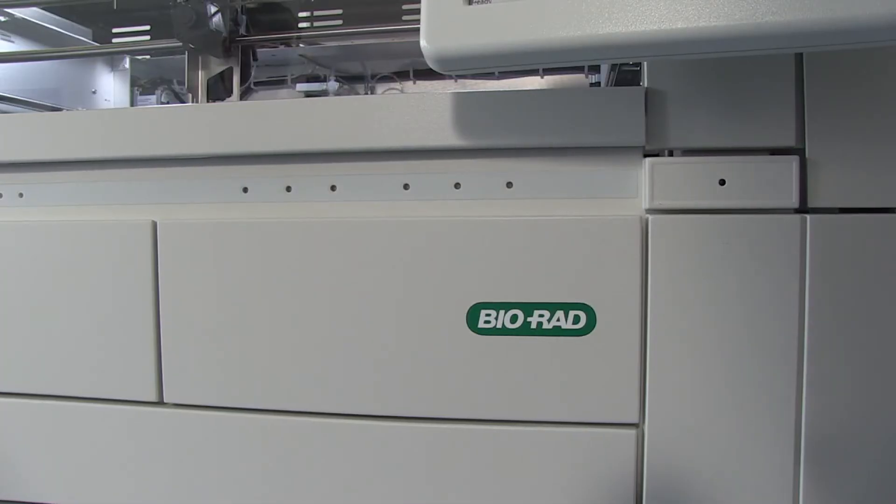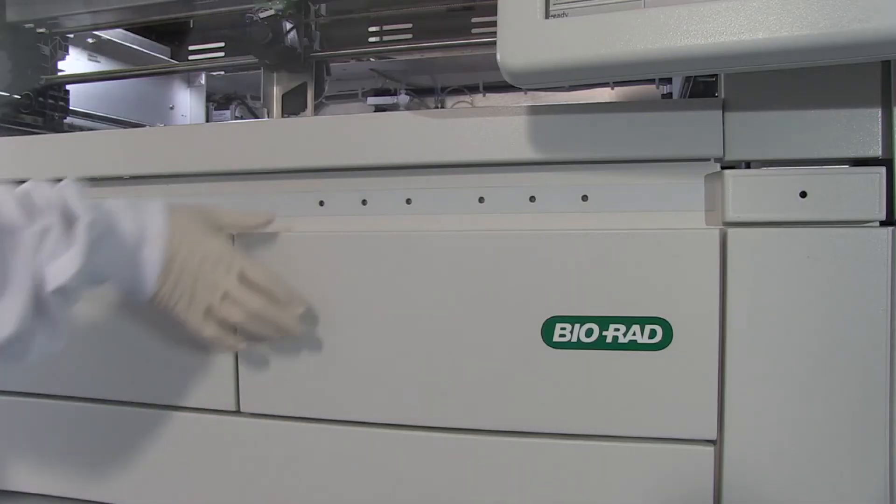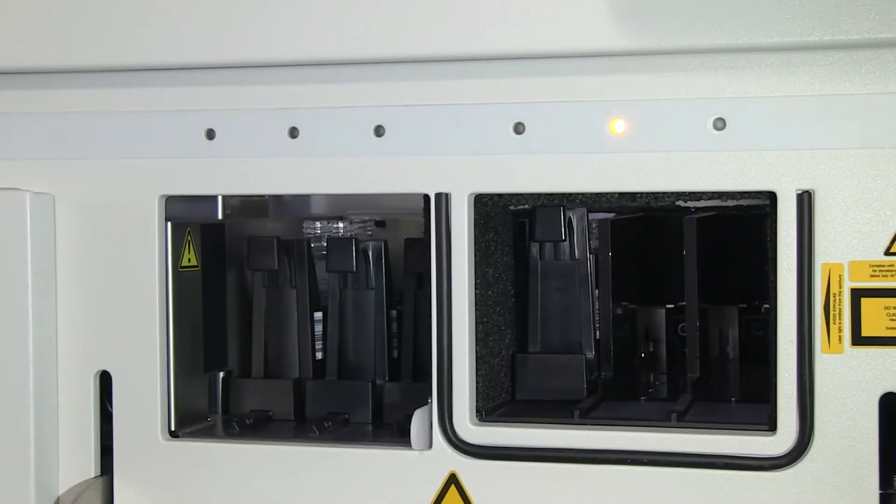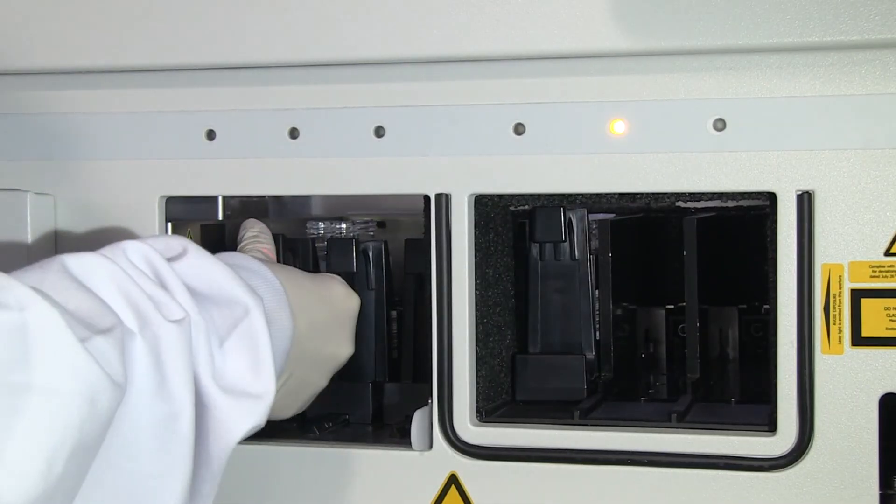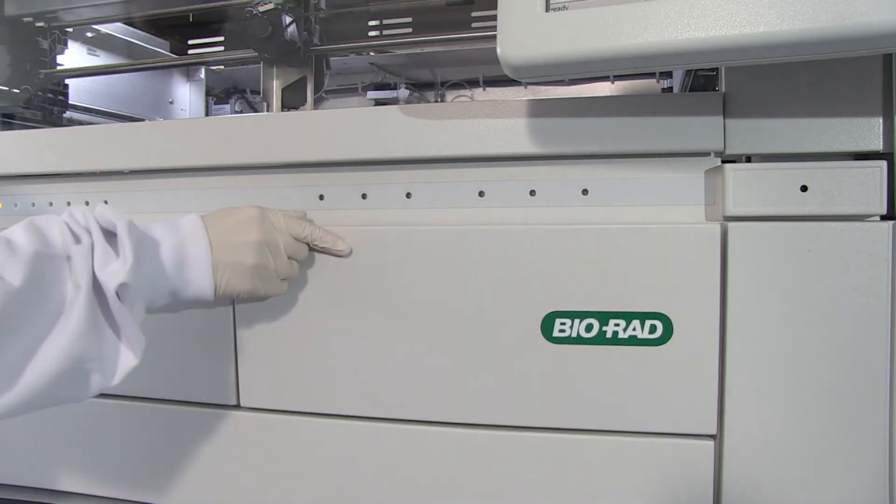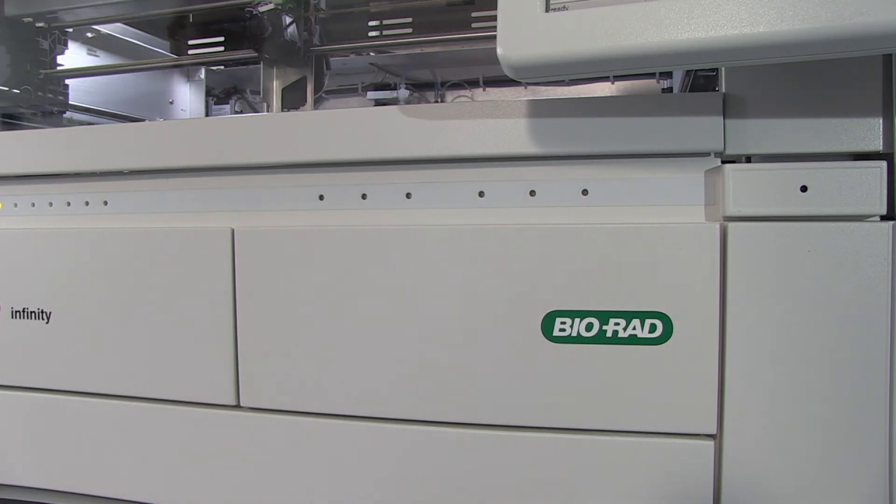Reagents may be removed at any time when the Tango Infinity is in ready status. To unload a reagent rack, open the door of the reagent bay. Unlock the reagent rack by pushing it. Pull the reagent rack out from the reagent bay. After all reagent racks are unloaded, close the door of the reagent bay.